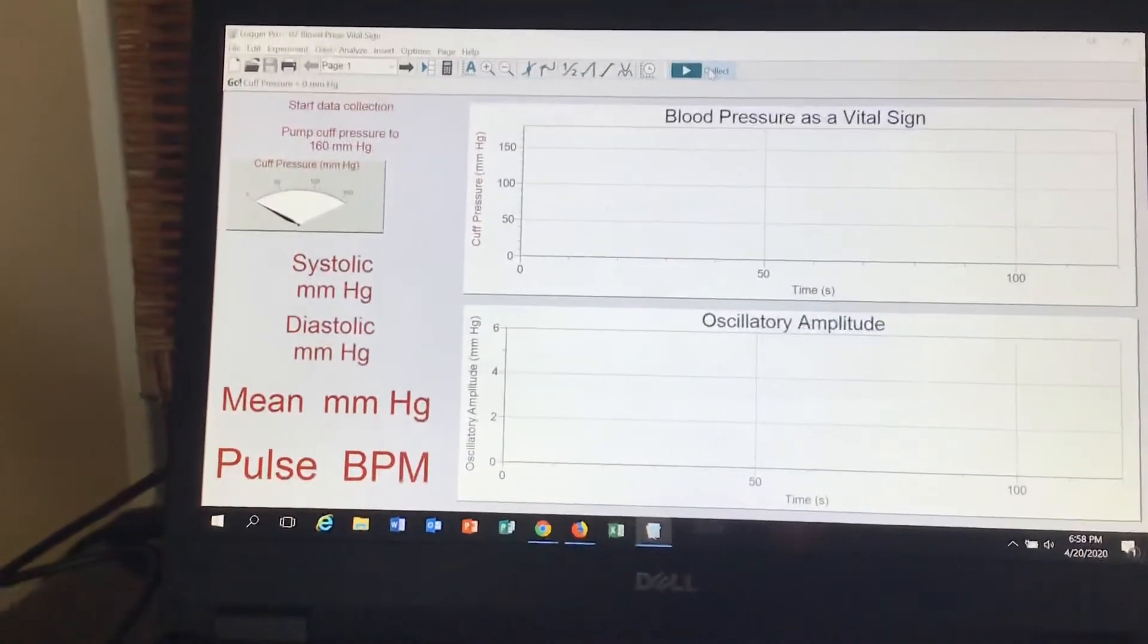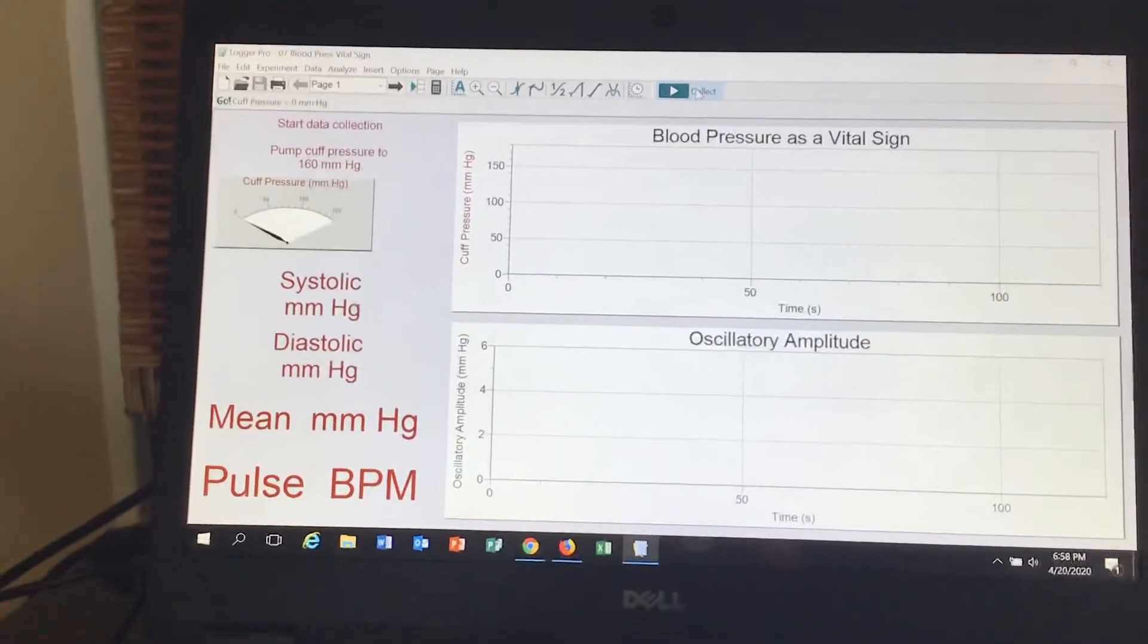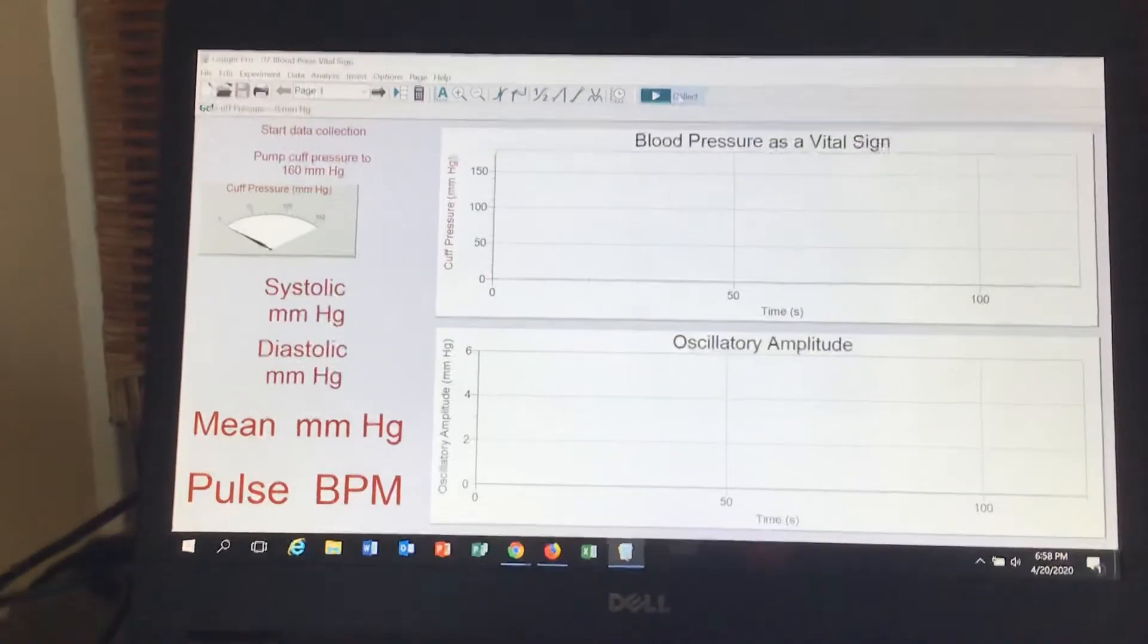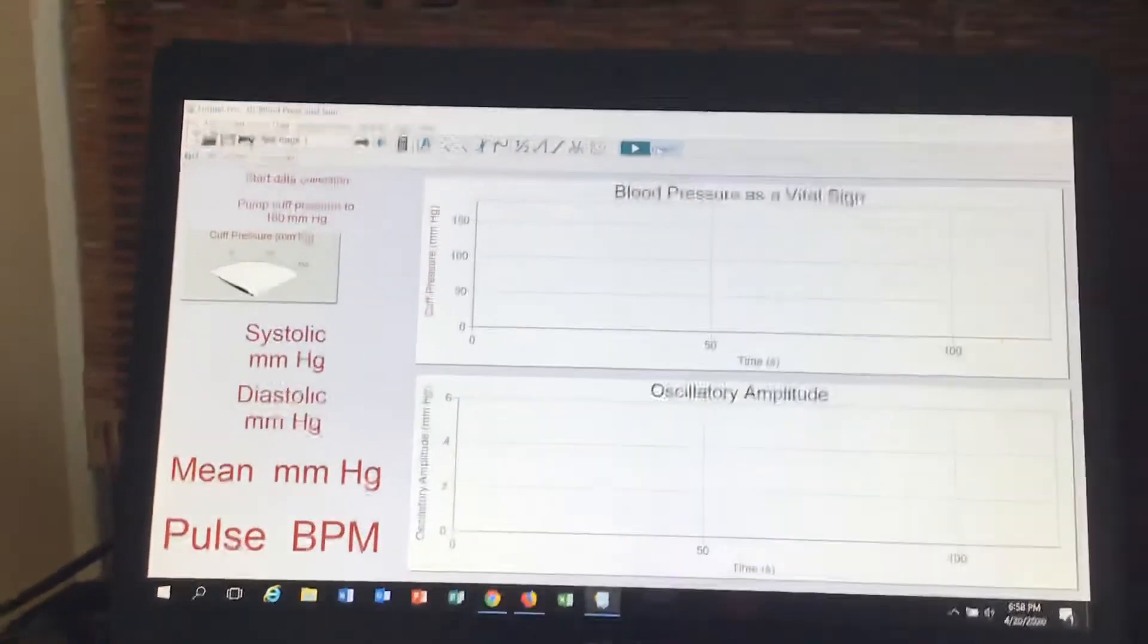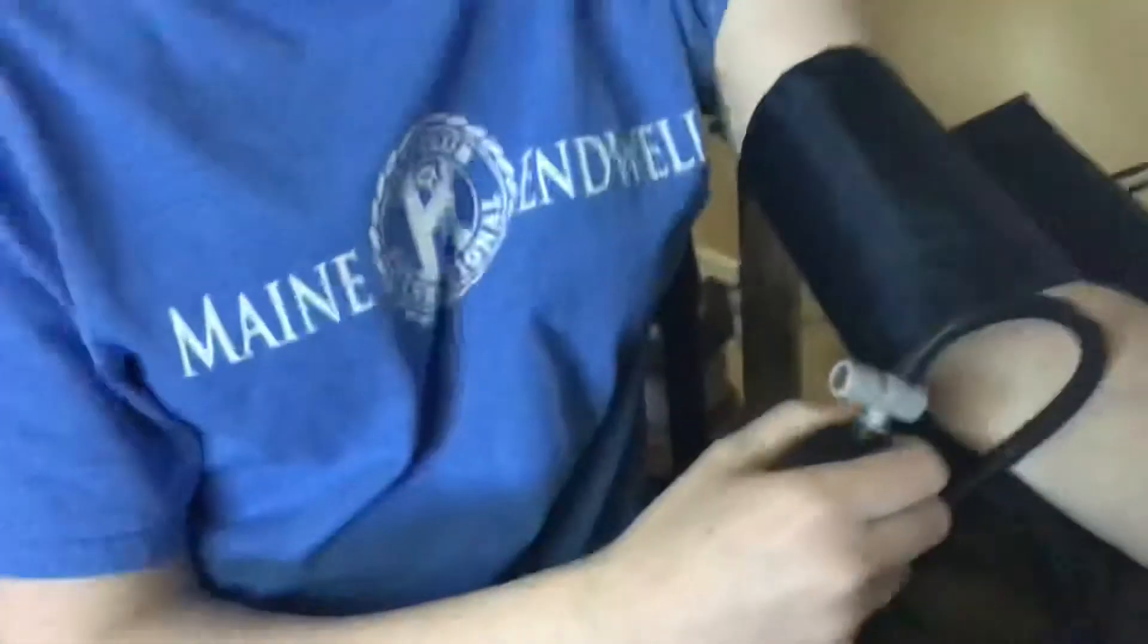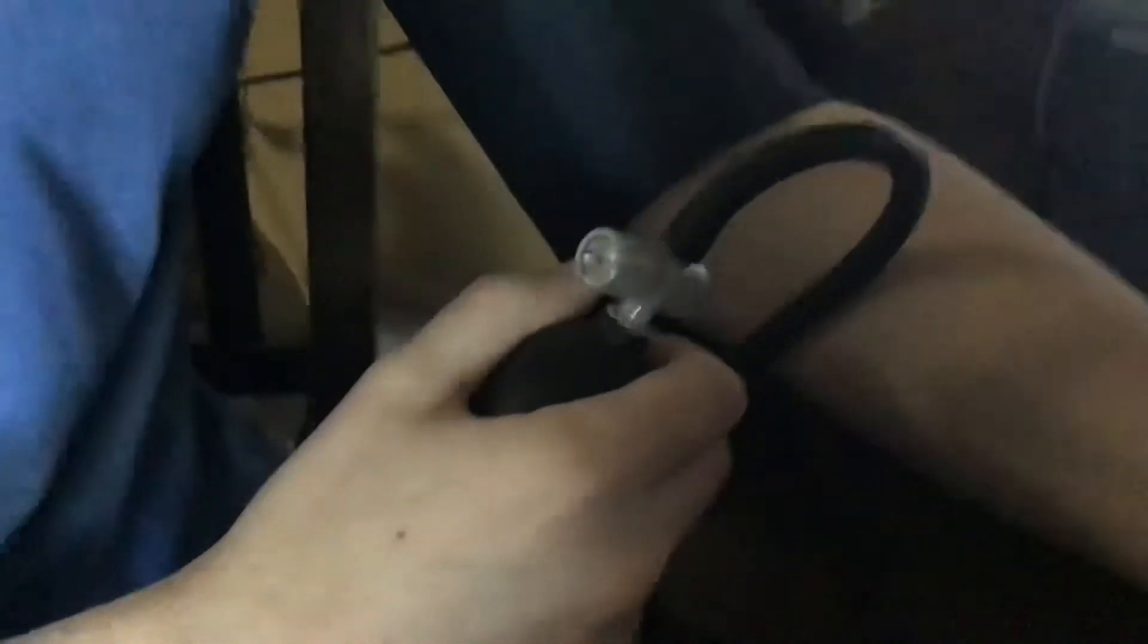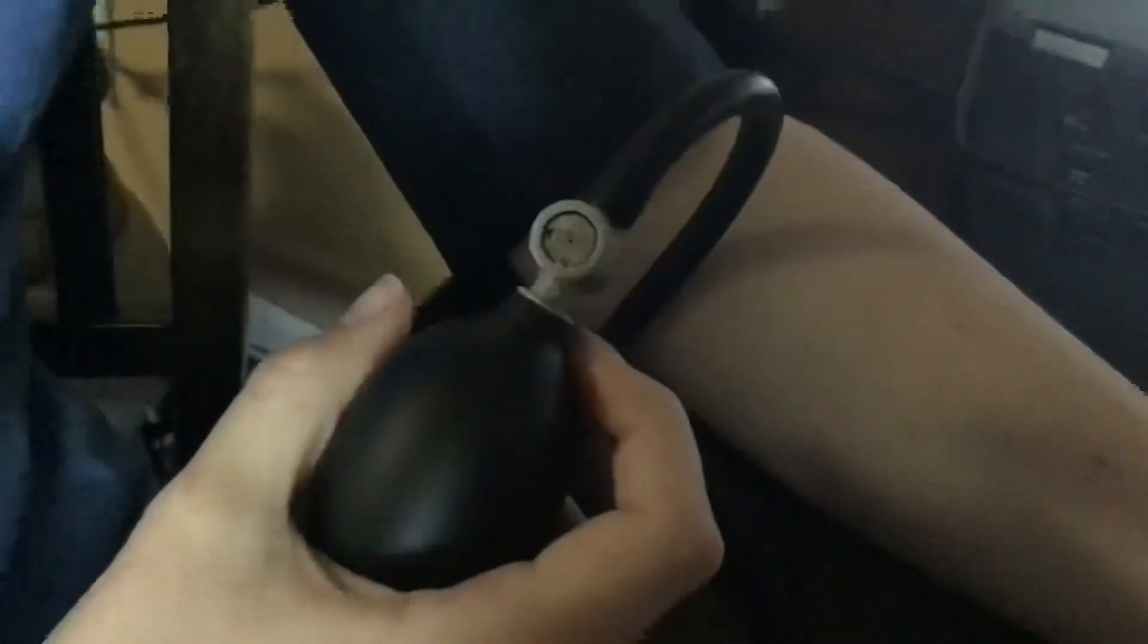Okay, and of course with PLTW there is a Vernier program that links right to it. They make a blood pressure sensor that is hooked up to a cuff with a manual bulb. This bulb has a release valve on it - you can see the little hole in the center - and it's designed to release air slowly.